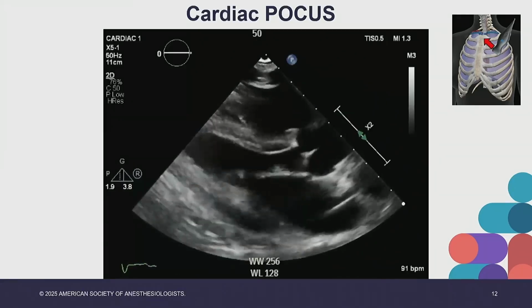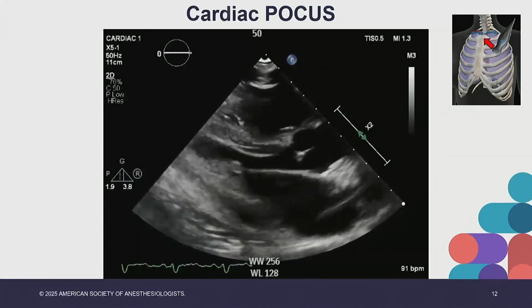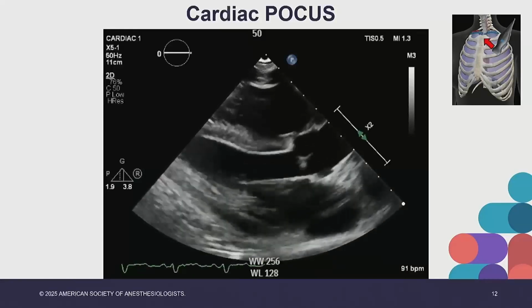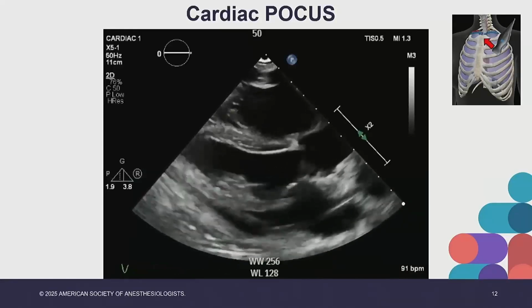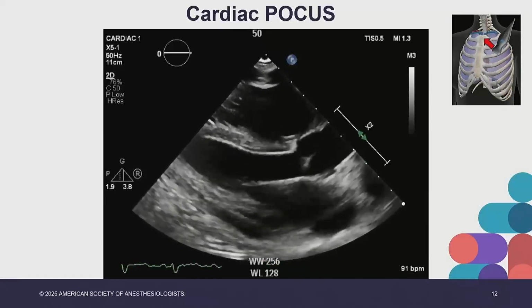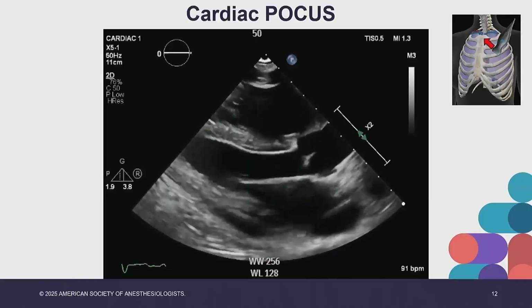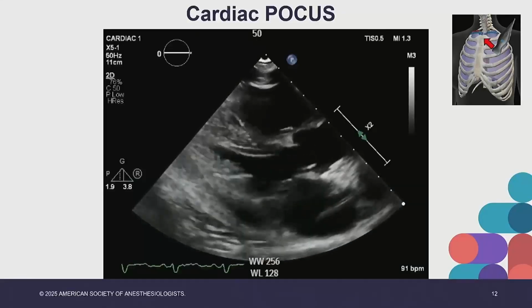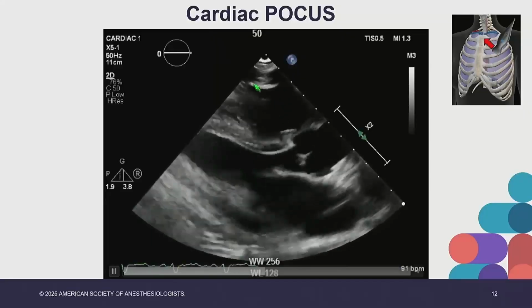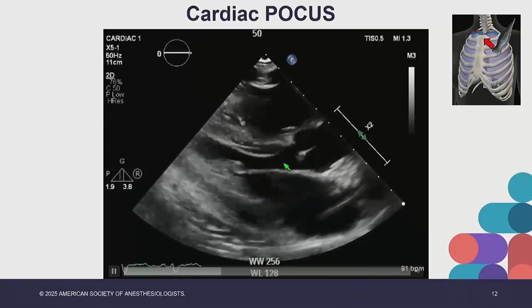And so when we looked at this patient, this is the parasternal long axis view. You can see in the upper right, this is second or third intercostal space, probe marker pointed to the right shoulder. This is, I find, to be the easiest view to get in the pregnant patient, and that agrees with Dr. Ortner's study. But you can see that this is the right ventricle here. This is the left ventricle and long axis. Here's the mitral valve. Here's the aortic valve.